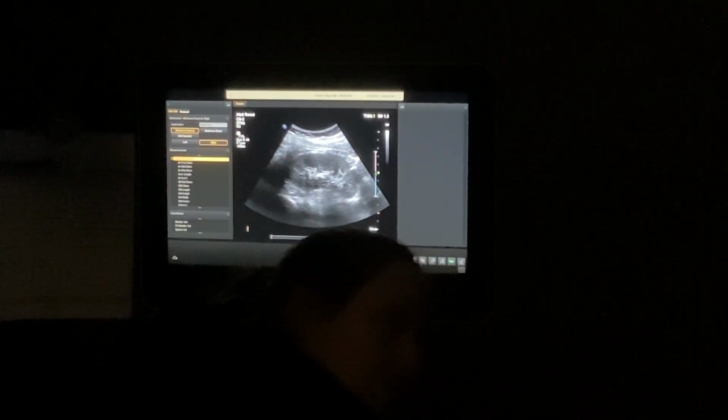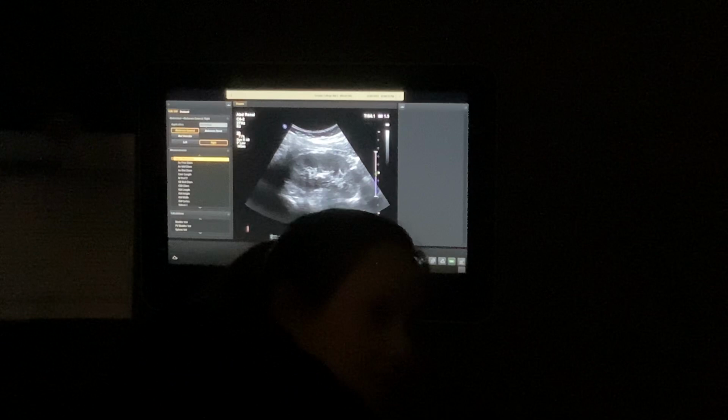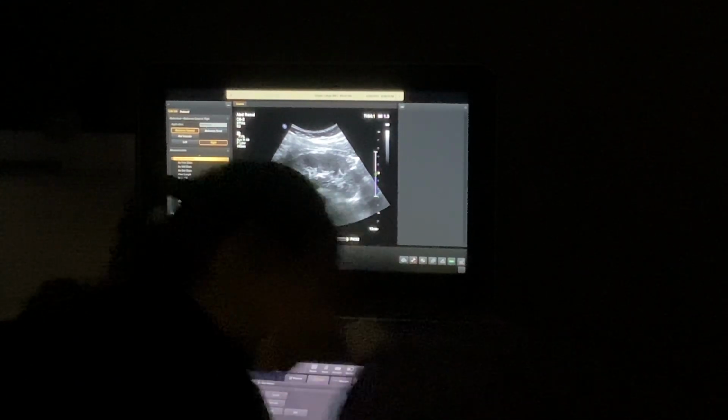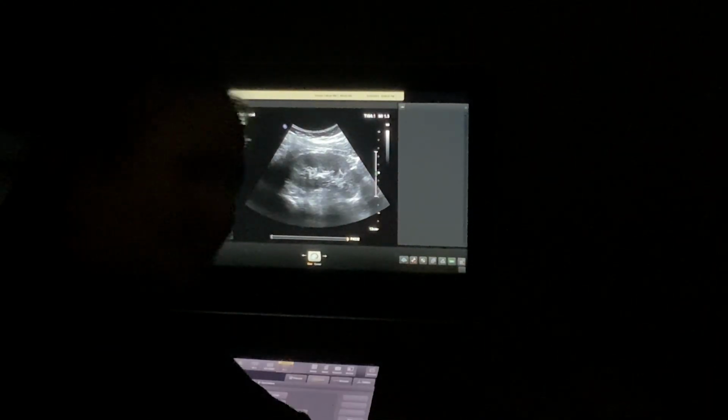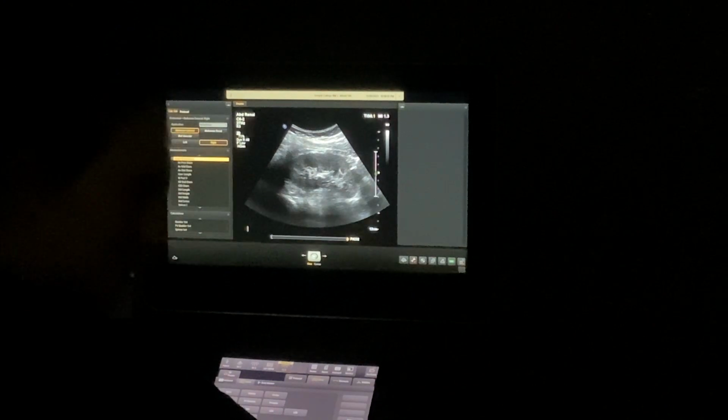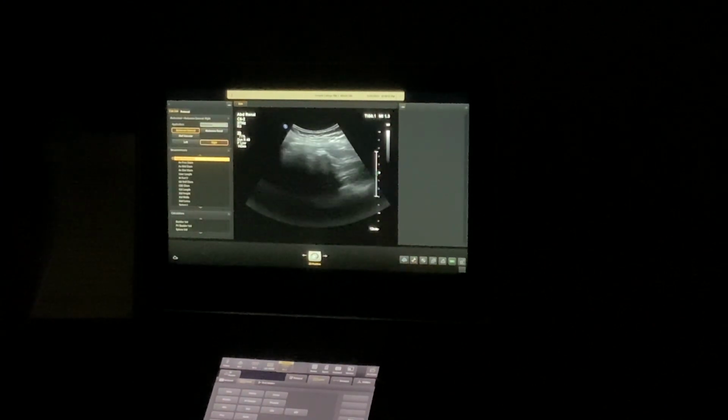Do I look comfortable? No. Not. This hurts, and the longer it takes me to scan your kidney, the more it's gonna hurt. Why don't you flip on your side for me? If you find yourself getting all the way back and you're like, yeah, flip them, because look how much easier that is. Don't I look more comfortable now? Deep breath.